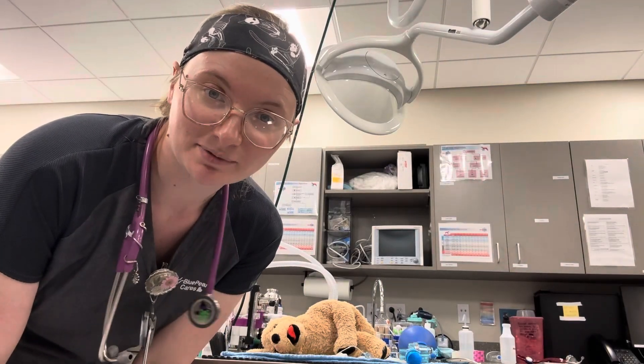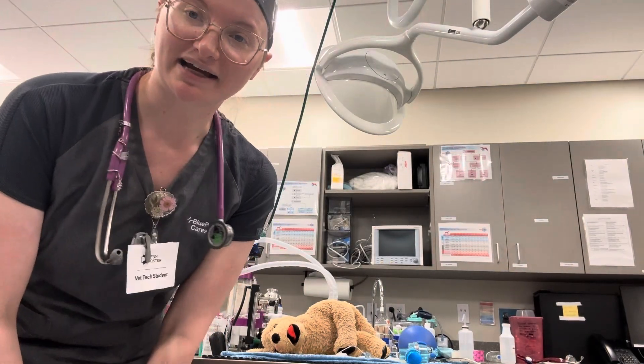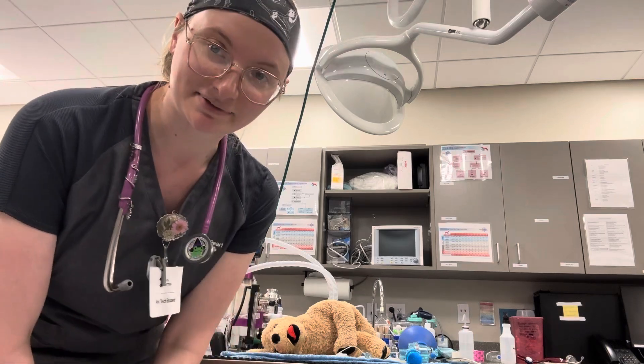My name is Abby Taylor. Today is October 19th and today I'll be demonstrating how to perform basic life support in a canine patient model.